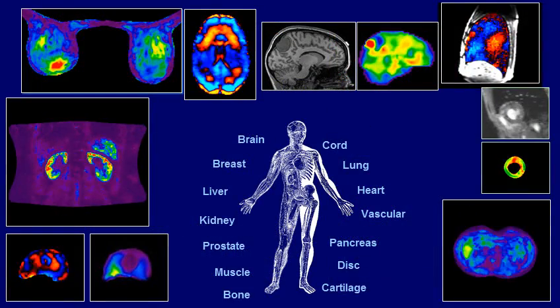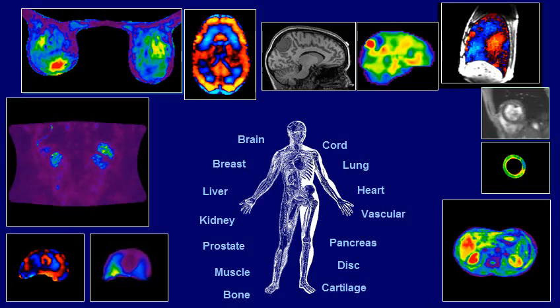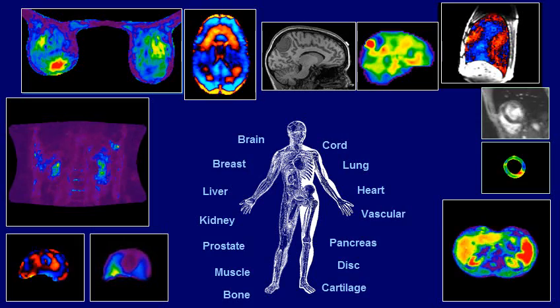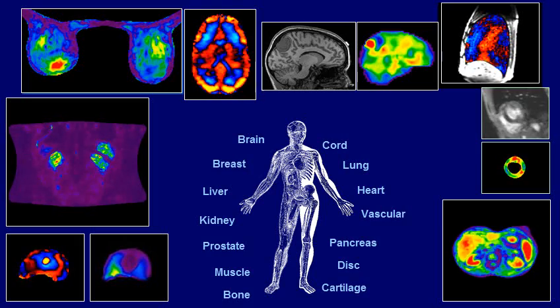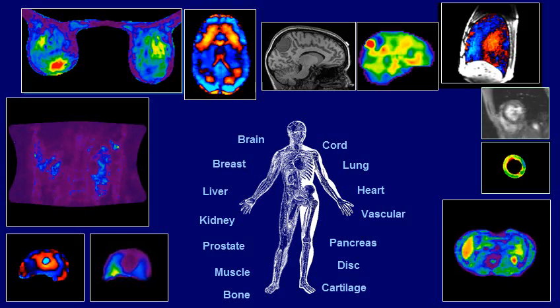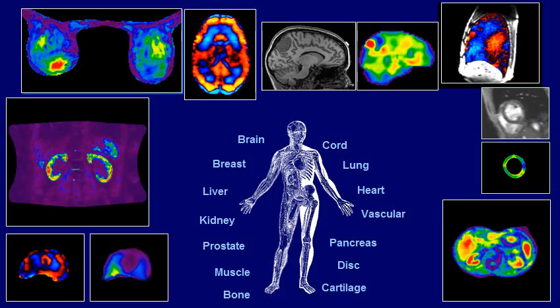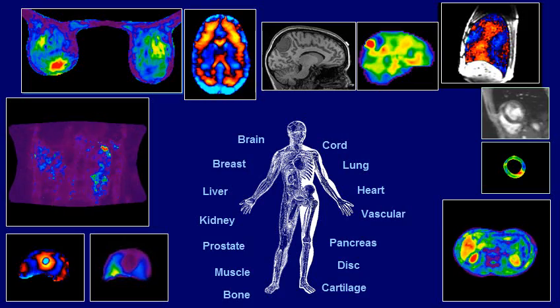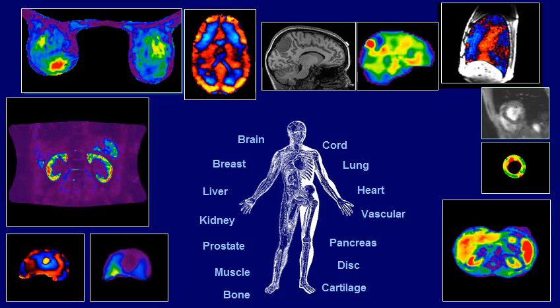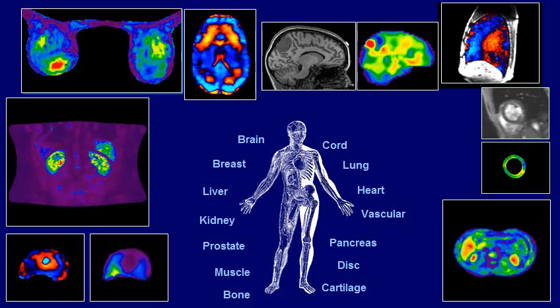Investigators are now looking into many other applications of MR elastography. Those would include assessing breast cancer, kidney disease, prostate cancer, assessing the pancreas, the heart, and the lungs. At this time, it seems most likely that the next widely accepted application of MRE will be for brain imaging, particularly for preoperative planning in patients who have brain tumors, especially tumors like meningiomas and skull-based tumors.